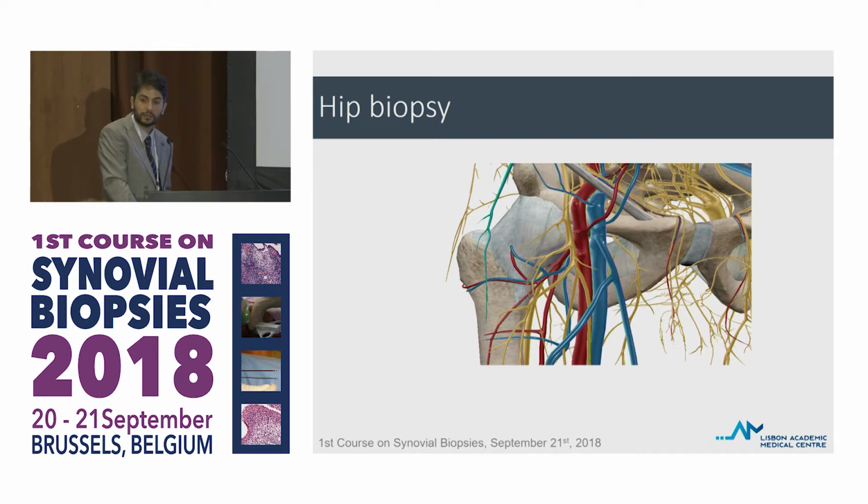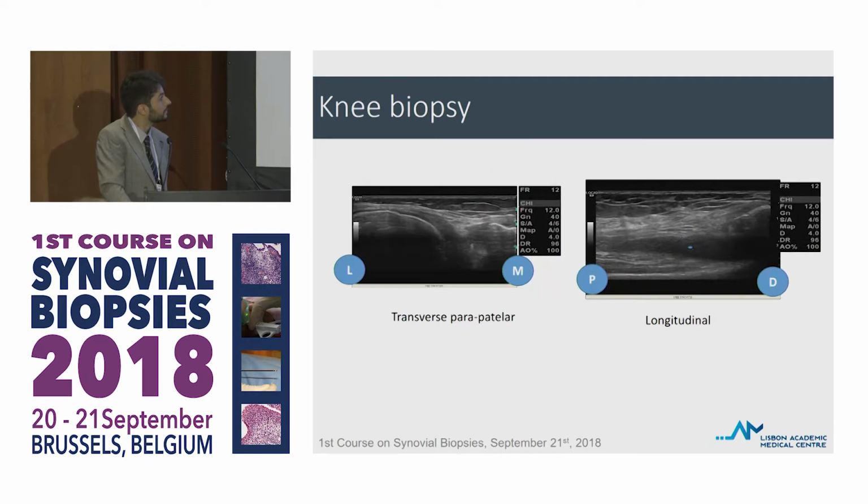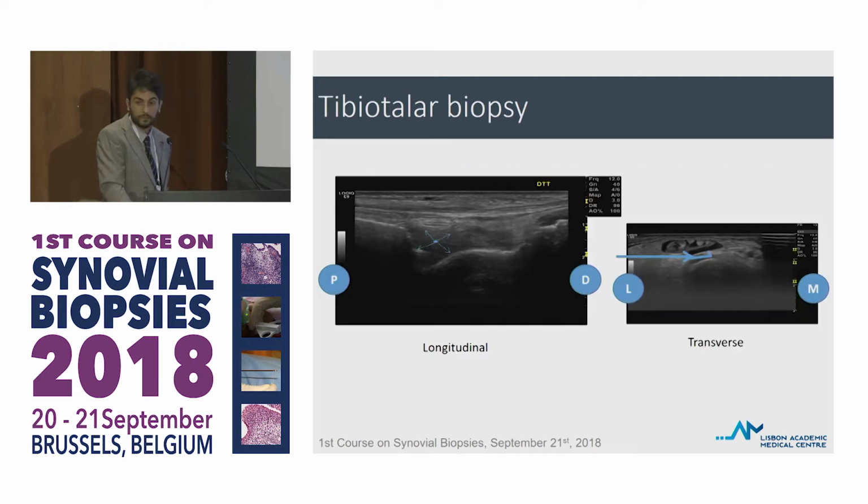Can I ask a question about the ankle? Yes. Some of us that were brought up when we did blind needle injections without ultrasound went anteriorly, laterally to the tibialis anterior tendon, and that's a big cavity. Is there some reason why you prefer the lateral approach? Yes, there is, and the reason is that we always have to push the open throw against the synovium, and doing it anteriorly, if I do that anteriorly, I will go through the cartilage probably or the periosteum after opening the throw, and that's the reason why. And apart from that, of course, if we go, let me push a little bit back.